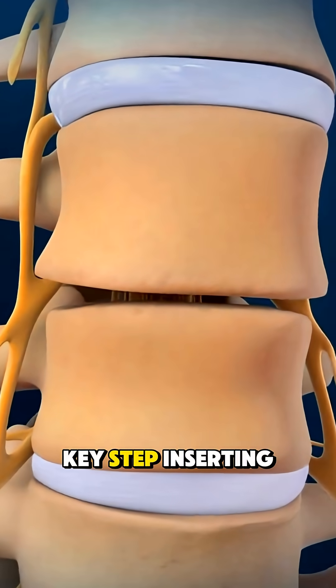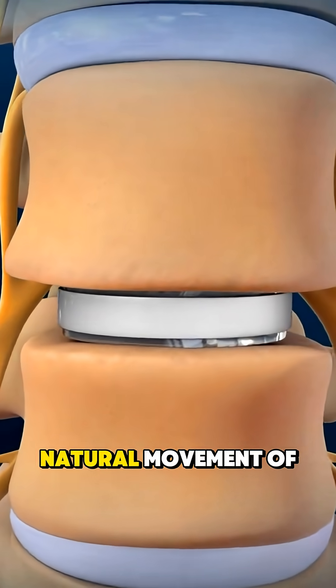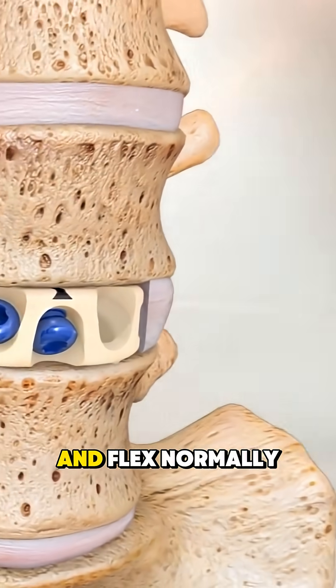Then comes the key step: inserting an artificial disc designed to mimic the natural movement of a healthy one. The implant is positioned with extreme precision so the spine can bend, twist, and flex normally.